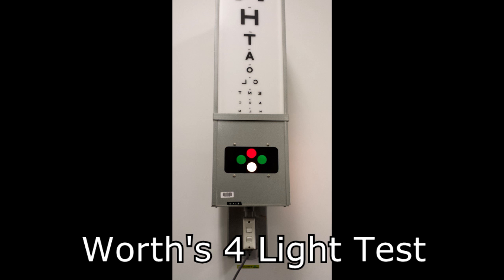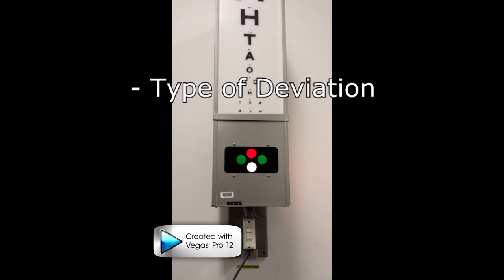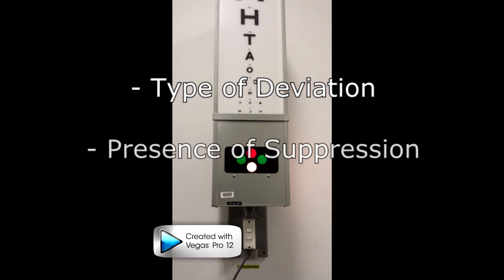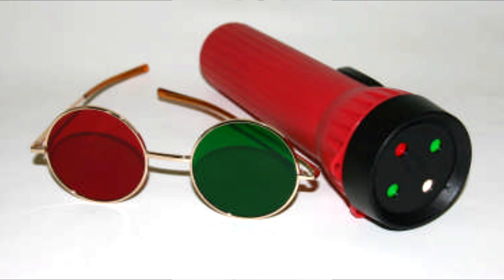We will now be performing the Worth 4 Light test. This test is used to identify the type of the deviation by determining the type of diplopia, and it can also indicate suppression. Note that usually the test is performed under dim condition, but due to the circumstance, the light will be on. Also note that this test will be performed at distance, which is 6 metres, but there is also a near form which uses a Worth 4 Light pen torch.